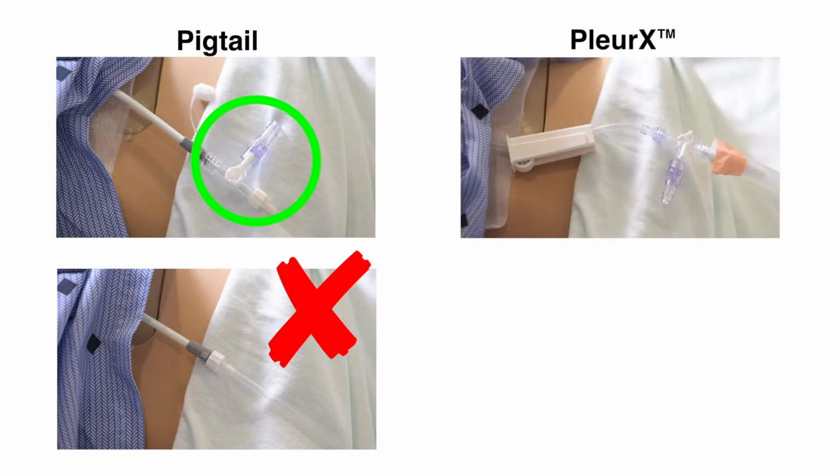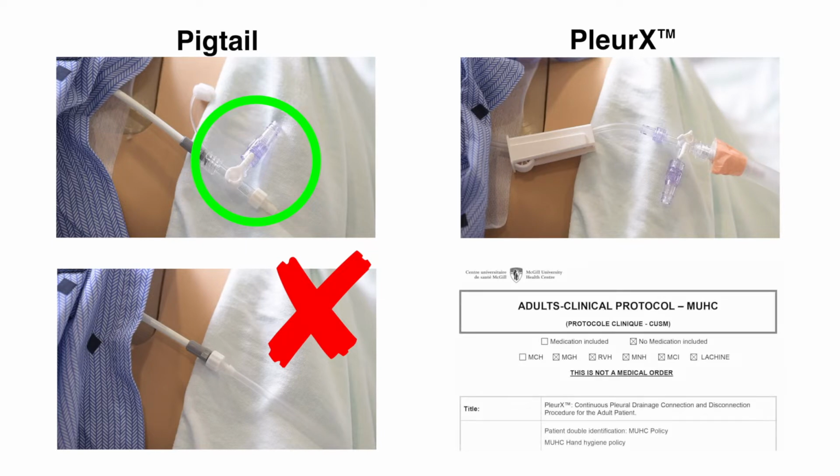A nurse can install the three-way connector to the pleurex drain. See pleurex, continuous pleural drain connection and disconnection procedure for the adult patient. At any time, the nurse can install the needle-free connector.